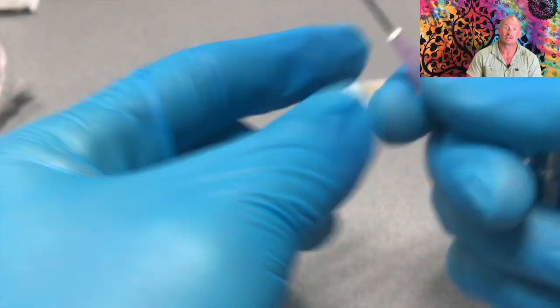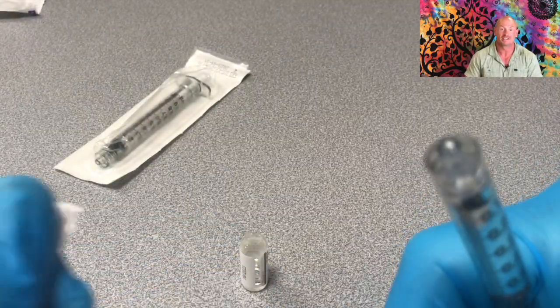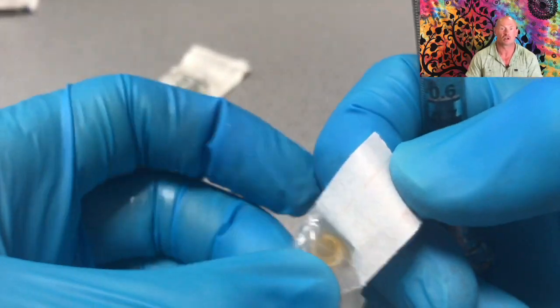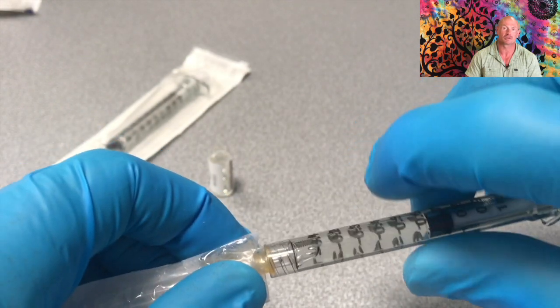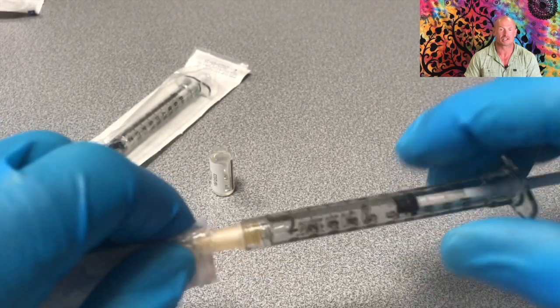Next, put on the injection needle — this is a 25g needle — without uncapping it. This syringe you can simply store at room temperature, as you would store the glass ampoule. Put it in a cool, dark place away from sunlight, for example in a drawer, and leave it there until you need your next injection.